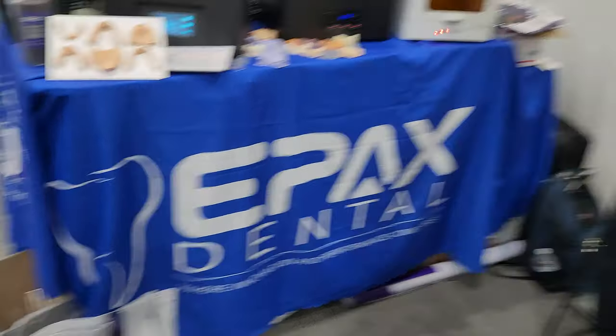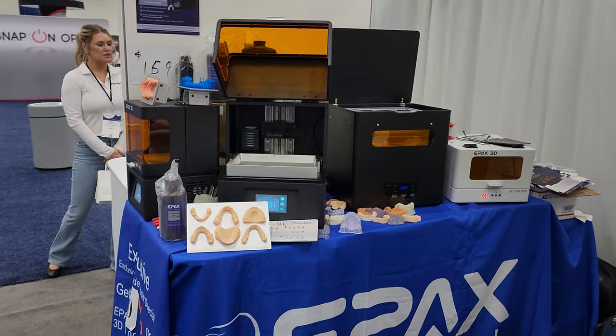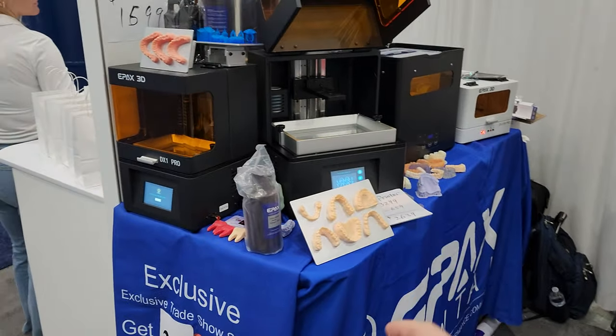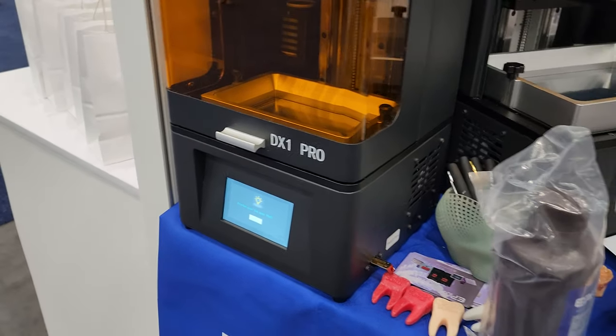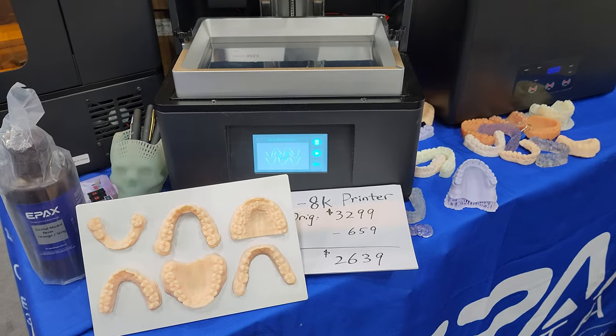Alright guys, I'm here at the Epax Dental booth and you can see it's nice and quiet over here. Very cool. I really like their display. You have a little booth like this and you have to make the most of your space, and they were able to kill it. They got a smaller model which is the DX1 Pro, and then you have this one here, which is the DX10 8K Pro.